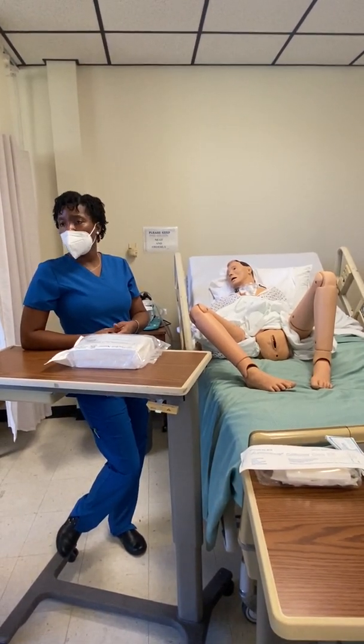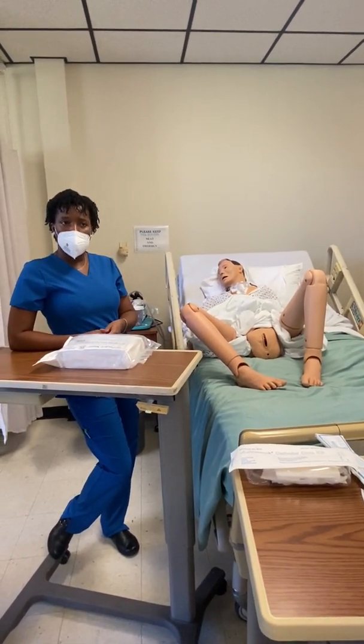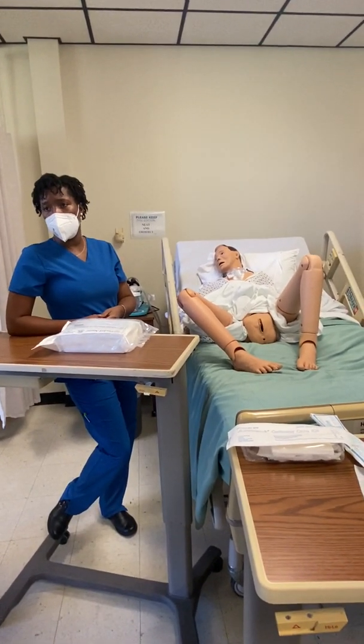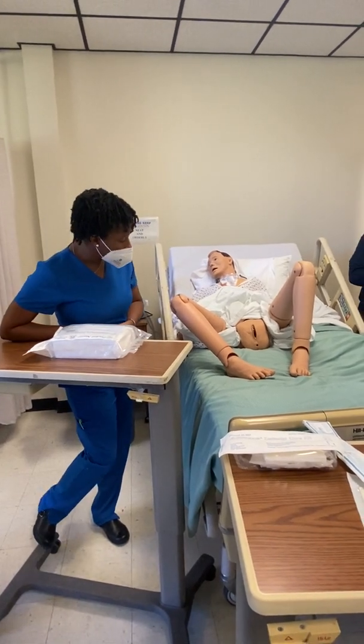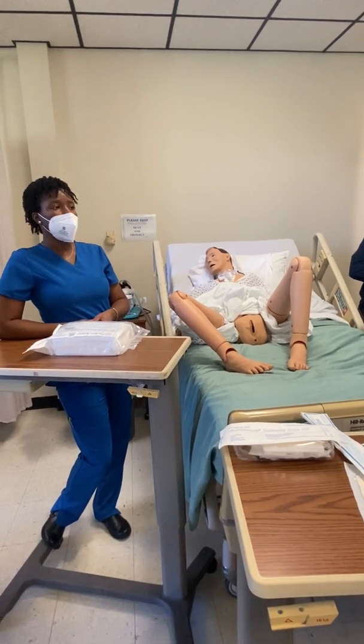Okay, so we're gonna look, and if they need perineal care, we're gonna clean them up, and then we have to go wash our hands again. Because we don't want to clean them up, put on sterile gloves, and go through with the procedure, okay? So make sure you mention that. You're gonna assess whether or not they need perineal care, and you can do all of that before you drape them or anything, just to know what you have to do.